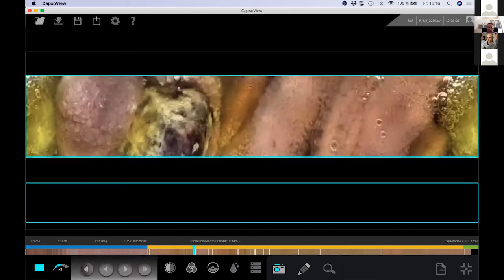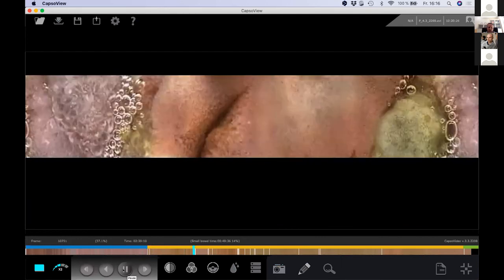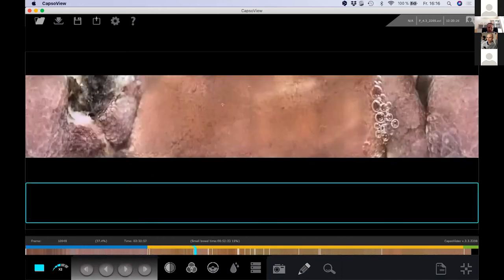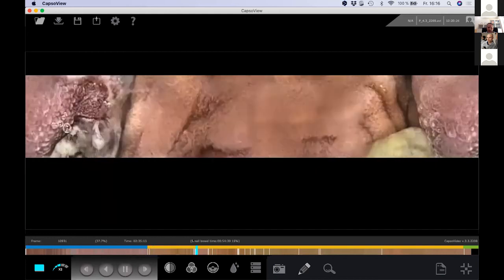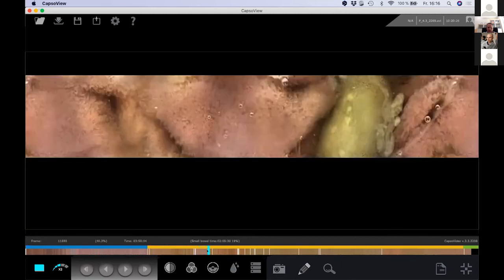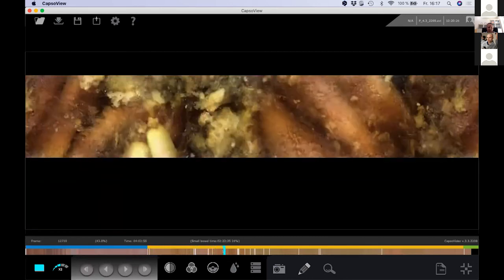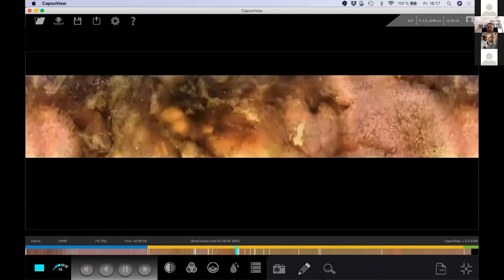You can see it much better. It's also an ulceration. And here, the tumor, this is a metastasis of a malignant melanoma. Also a young guy, nearby 30 years. You can see the black color of the melanoma in this area. But they are not every time really black. There you can see all the colors, but in this case, you can see it, and we have here the metastasis, and if we go down, we will find some others.